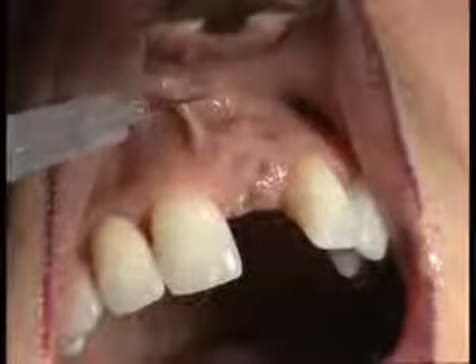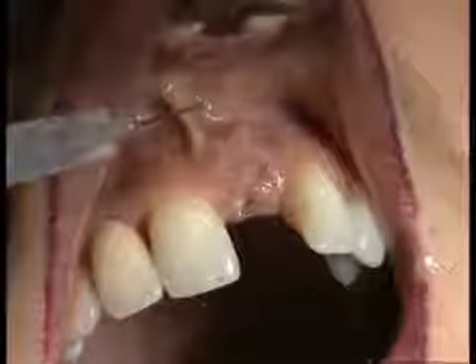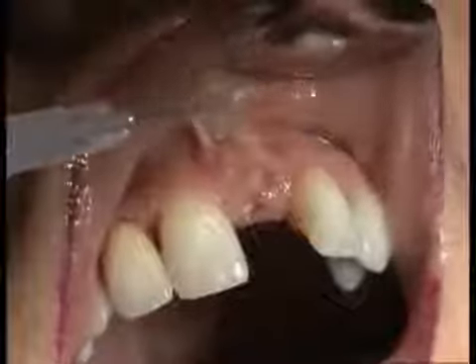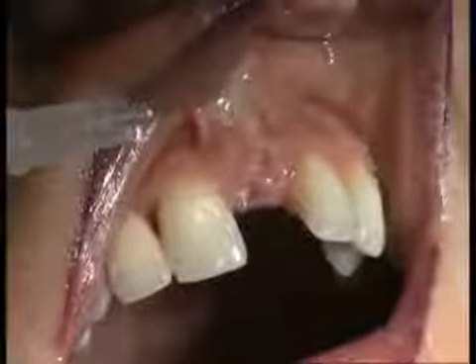The oral mucosa is locally infiltrated with anesthesia in preparation of surgical root removal and subsequent immediate implantation. The palatal mucosa is also included.